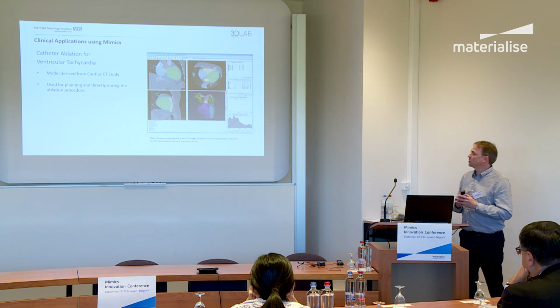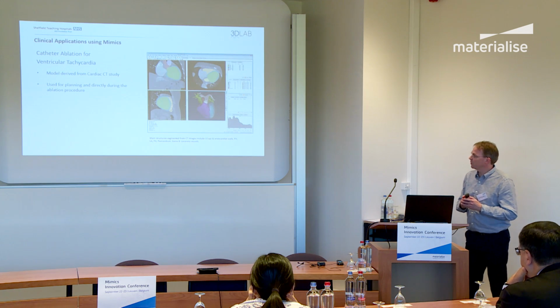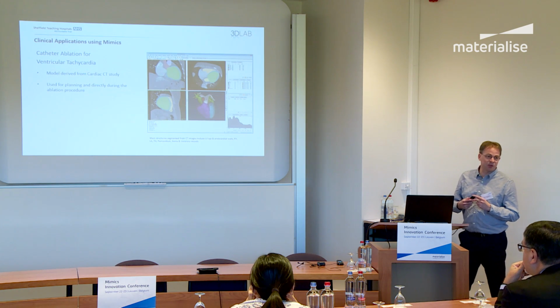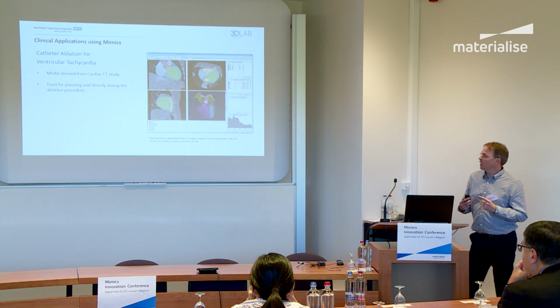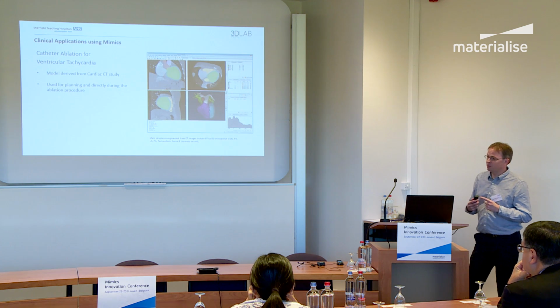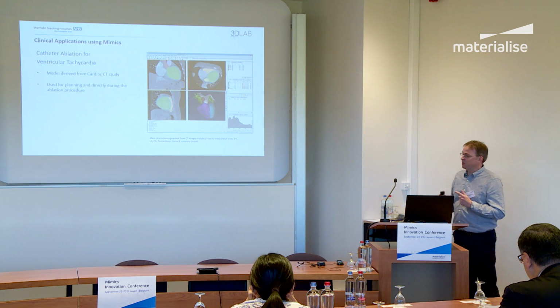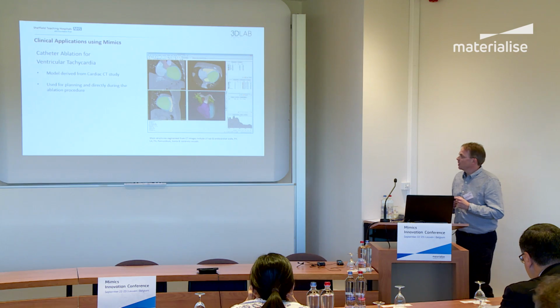And we've been using the Mimics software to segment the heart for catheter ablation for ventricular tachycardia. So in this procedure, a special catheter is inserted into the heart, and it's used to localize and then treat areas which are potentially giving these life-threatening arrhythmias.